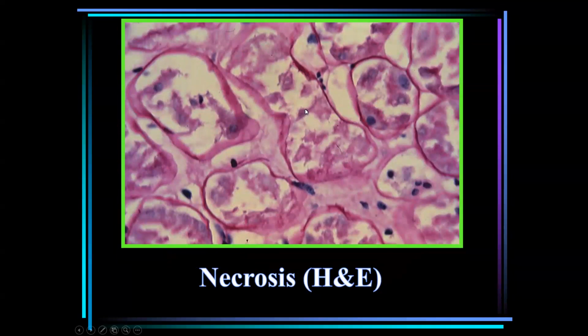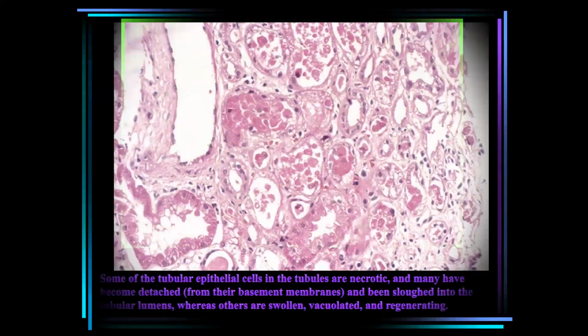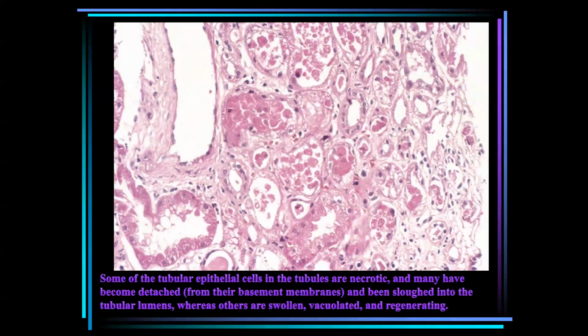It is to be noted that in this situation, if we look at the other items present in the pathology field, like the glomeruli, they will be normal. So the injury here is completely a tubular injury in the form of acute tubular injury, and it is a severe form of acute tubular necrosis. Again, as we see in this picture, many of the epithelial cells are detached and filling the lumen of the renal tubules. And again, this is another picture of acute tubular injury.